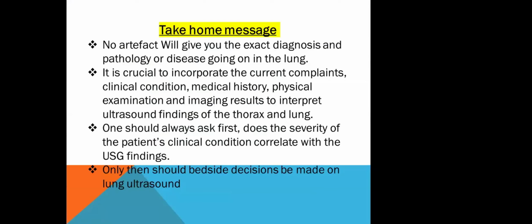So our take-home message from this session, I just tried to make it more concise because these might be for the initial phase. There is a lot more to learning lung ultrasound. This is just for the beginners. And you need to remember that no artifact will give you the exact diagnosis and pathology or disease going on in the lung.